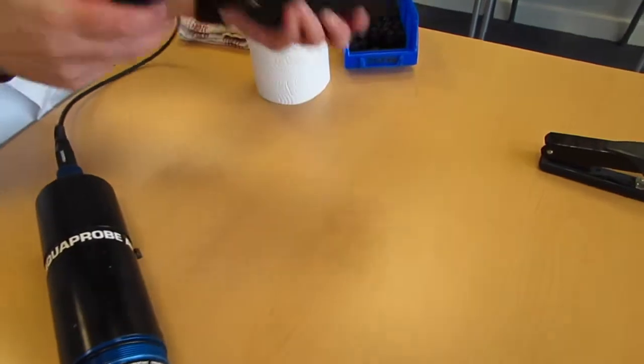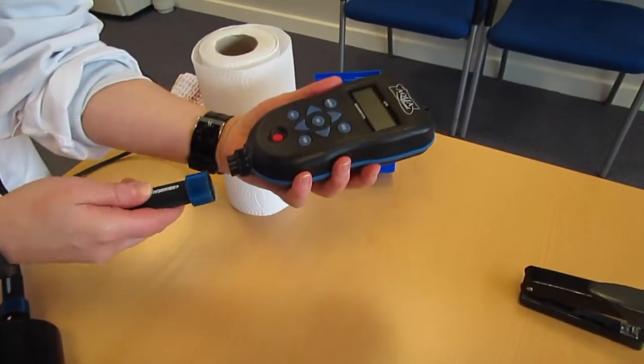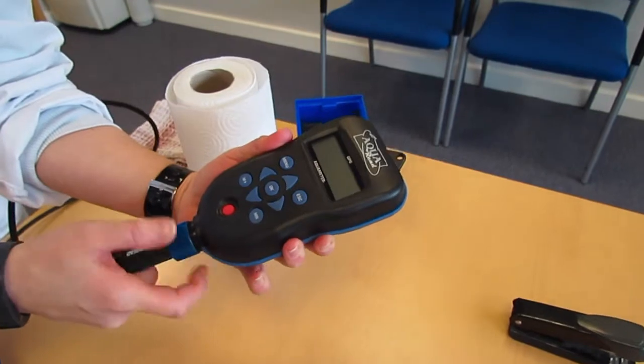The other end of the cable goes into the meter. Again the aqua-read symbol faces up. Firmly push this into the meter and screw down the blue collar.